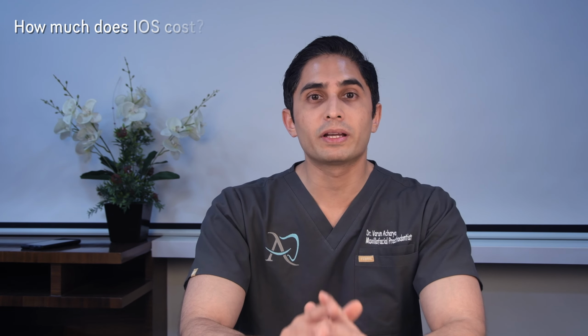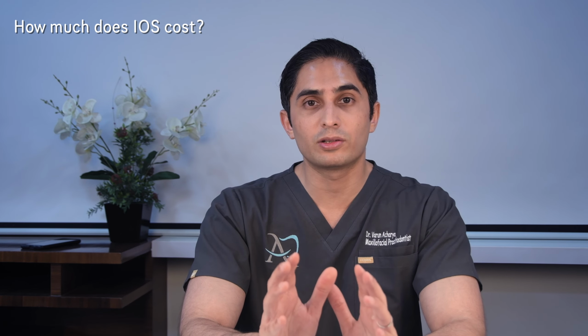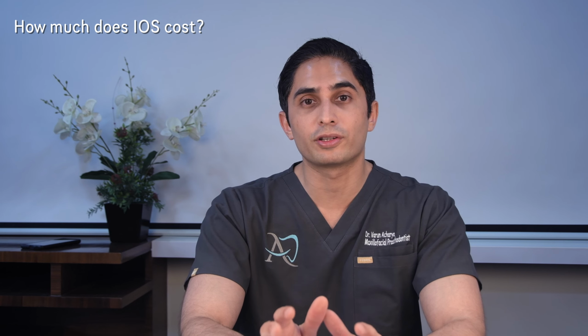Stability is something which could be a deal breaker for you, because if you've done all of that scanning and the system suddenly crashes, now you're going to be very, very frustrated with your user experience. Now, one big question to keep in mind is how much do these things cost, right? You need to figure that out and whether it's worth it for you to invest in it.